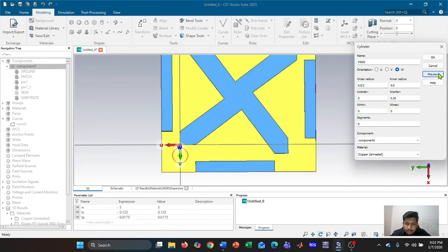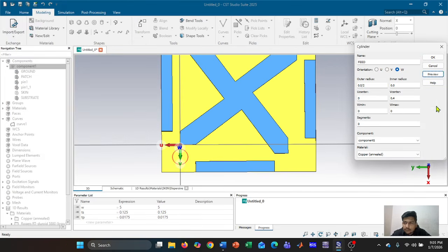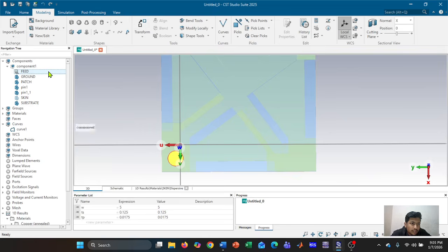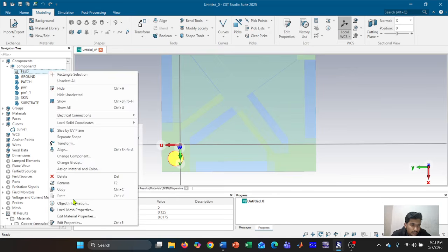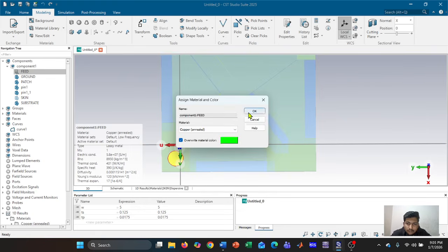0.35. Okay, 0.4. 0.4, 0.45. U center 0.15. Okay, now material is also copper. Okay, let's change the feed color. The material is changed to green.